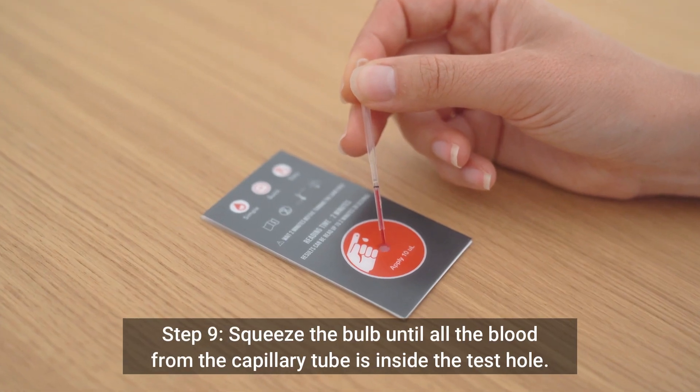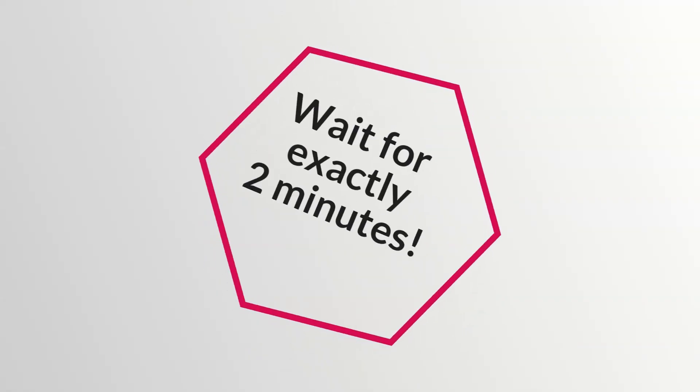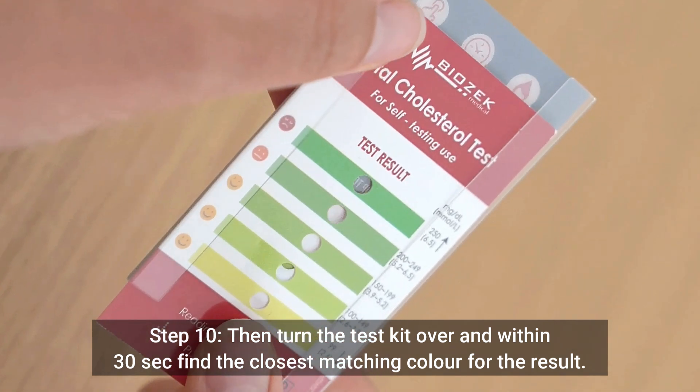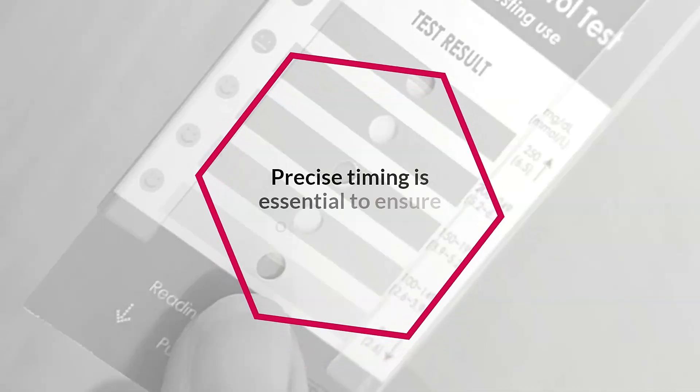Step 9: Squeeze the bulb until all the blood from the capillary tube is inside the test hole. Wait for exactly 2 minutes. Step 10: Then turn the test kit over and within 30 seconds, find the closest matching colour for the result. Precise timing is essential to ensure optimal results.